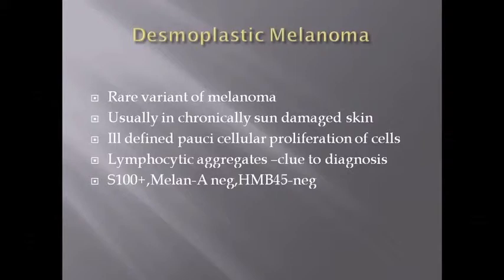Desmoplastic melanomas, again, another nightmare. They can be labeled as one of the difficult diagnoses to make if you don't have a proper history and the biopsies are tiny. If you have a good excision like I've shown you, maybe in the right clinical context, you would not miss a diagnosis. But in my experience, that is one of the most difficult diagnoses, which we can easily miss.